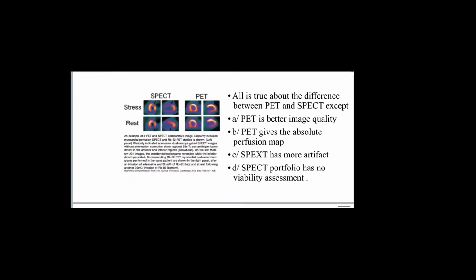Now this is SPECT and PET. Look at them, stress and rest. All is true about the difference between PET and SPECT, except: PET has better image quality. PET gives the absolute perfusion map. SPECT has more artifacts. SPECT has no viability assessment.